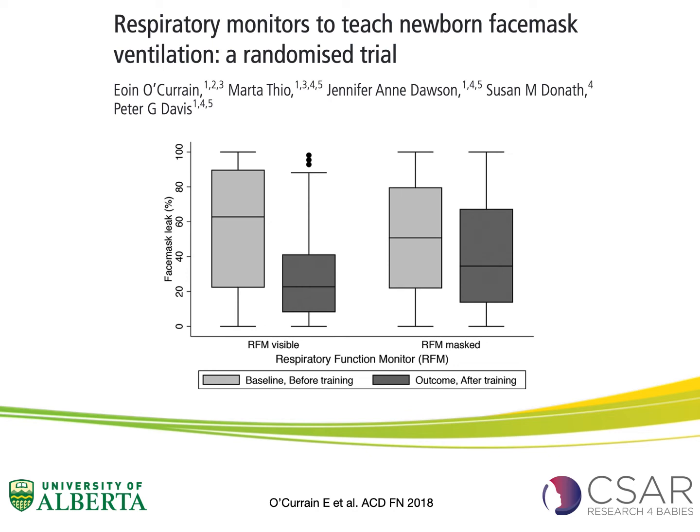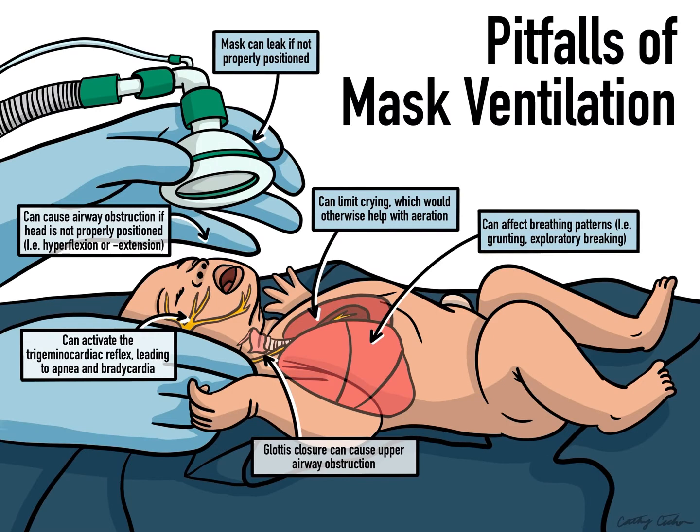However, there could be many reasons why this is the case, and certainly it needs further studies, but as it looks at the moment, it can help for reducing leak during simulated ventilation, but maybe not in the delivery room.